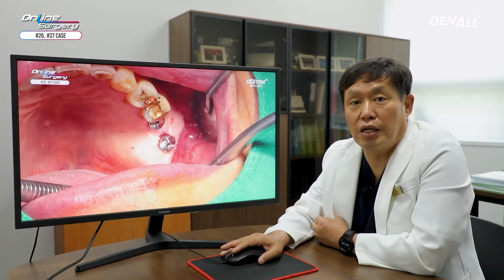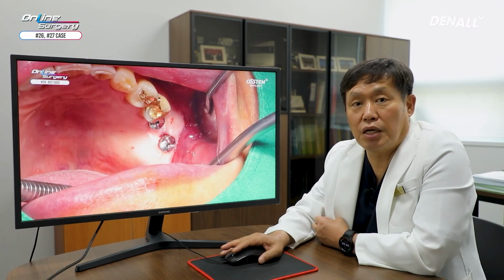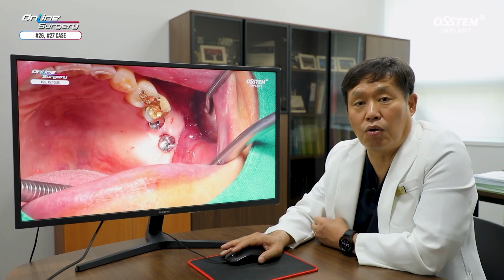Today, we have looked at a case where, after extraction, there was a defect and collagen was used for socket preservation. Thereafter, one guide was used to place implants. The biopsy results showed that from collagen, new bone formation was nicely done. As of late, a lot of positive reviews are being made about collagen. If you use it for socket preservation, you'll be able to gain favorable results. Today's case was about using one guide rather than one cast, involving the sinus floor a little bit for implant placement.